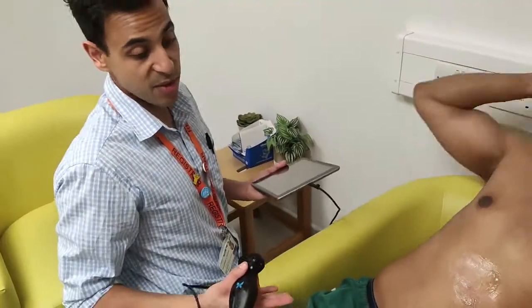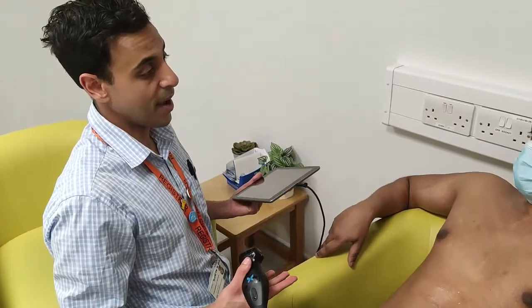But there, very quickly, we've had a look at the bladder. We know that urine is being produced, but there's no obstruction. The kidneys don't look hydronephrotic.